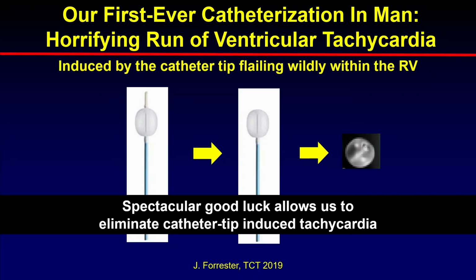But that's exactly what can happen if you're trying to figure out what's going on in a really sick patient. You say, I'm going to do a Swan, I'm going to figure this information out. You can cause a complication when you do it. You have to persevere and figure out how to avoid the complication, what the downside is, and how I can do it more safely.